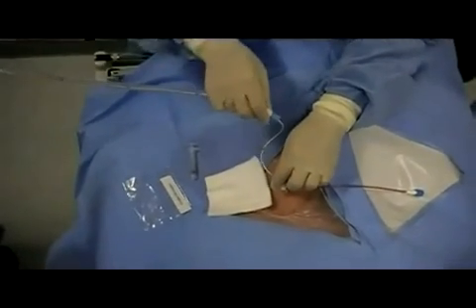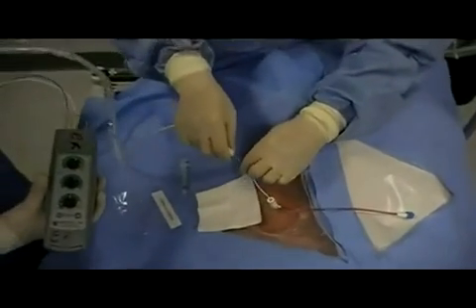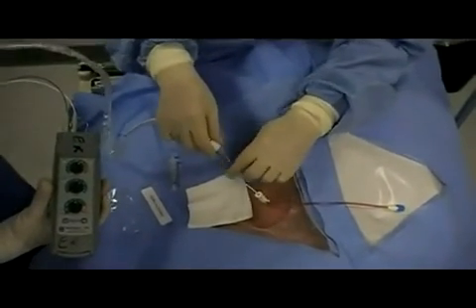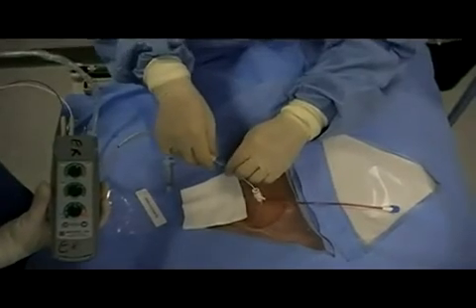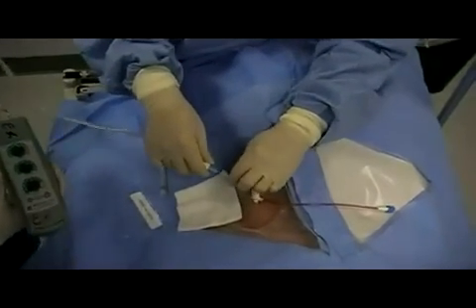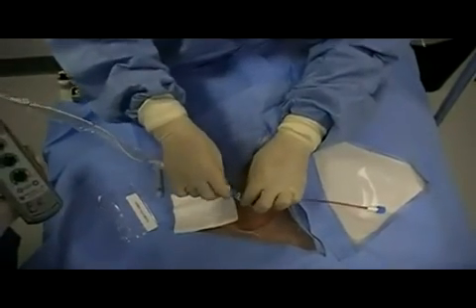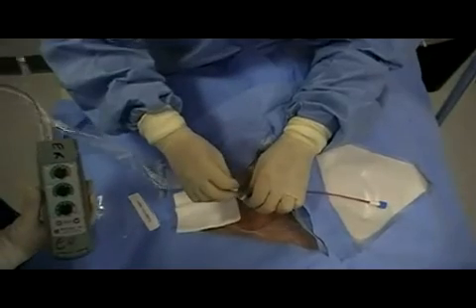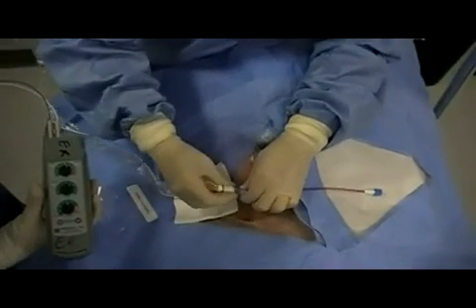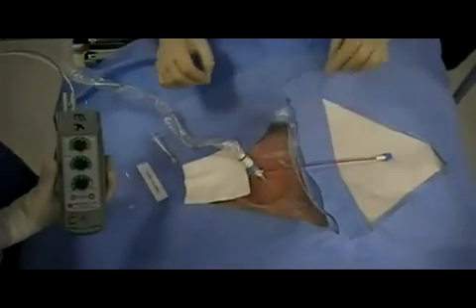The sheath should connect securely to the cordis catheter. Once the sheath is secured, the entire line should be secured using 3-0 silk on a straight needle.